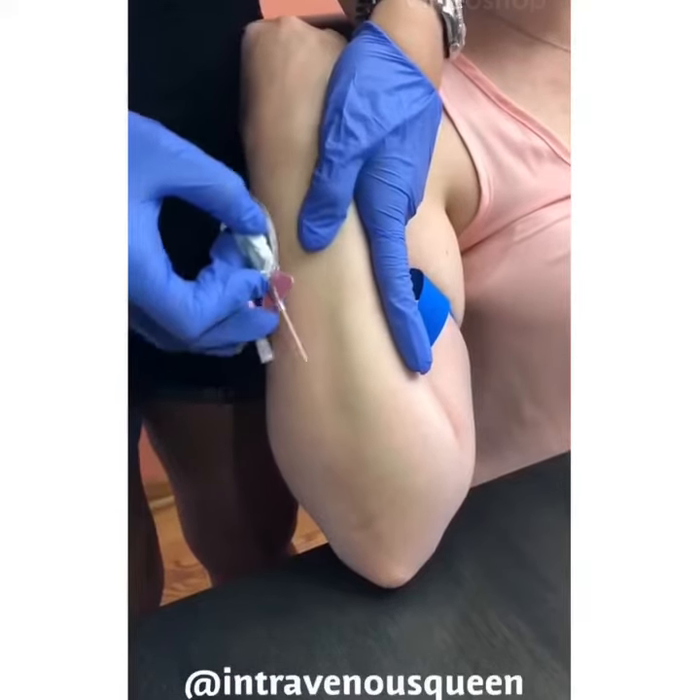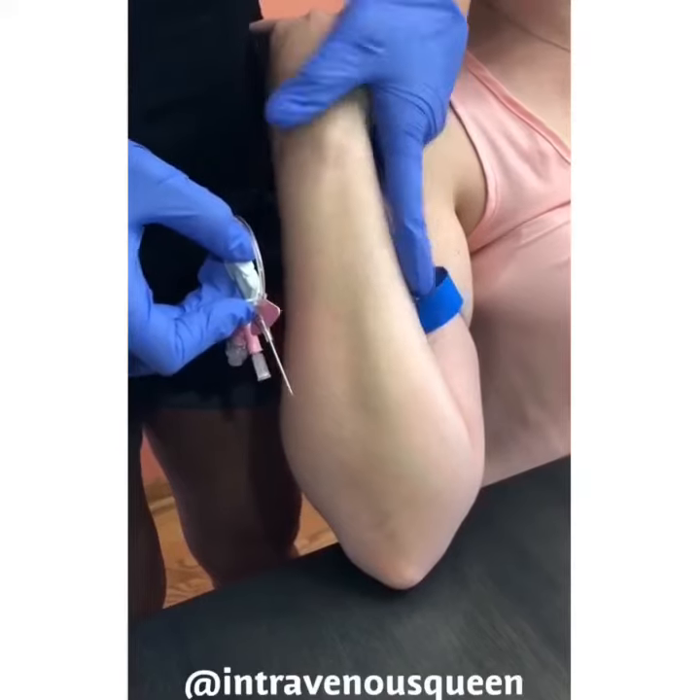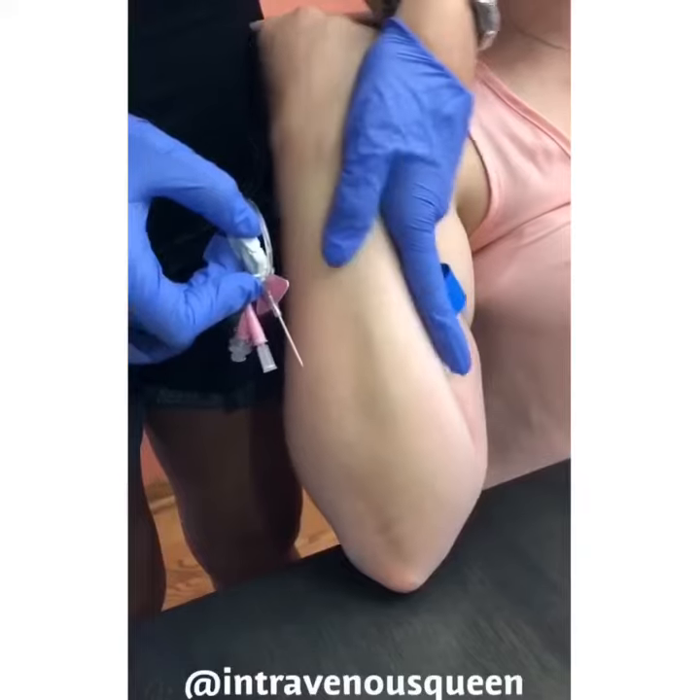I find that it's easiest to perform IV insertion on the same arm that you're dominant in. I am right-handed and this IV will be inserted on the patient's right forearm.